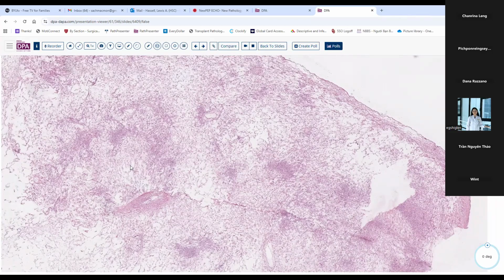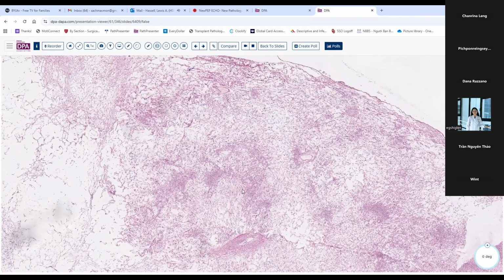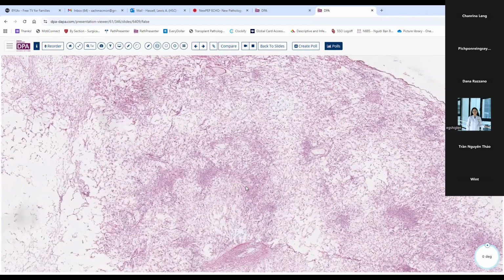I haven't seen a case of massive edema in the frozen, so I was going to ask you, Dr. Hassel, is it uncommon? Or have you seen few? It's relatively uncommon. I would say, in our practice, if we see one case every other year, that would be about my expectations as far as that goes. And that's where we're seeing a couple of ovarian frozen sections a day.